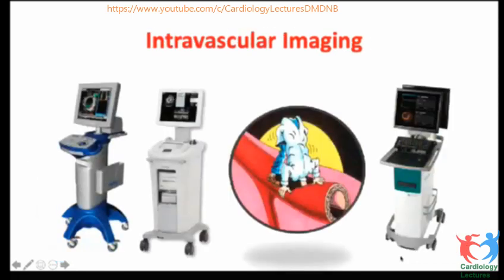Intravascular imaging, we have two commonly used modalities. One is IVUS, the sound-based modality. The second one is OCT, our light-based modality. Whether you use IVUS or OCT, both give useful additional information that supplement your coronary angiography in improving procedure outcomes.